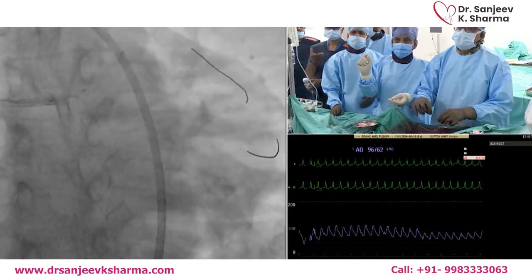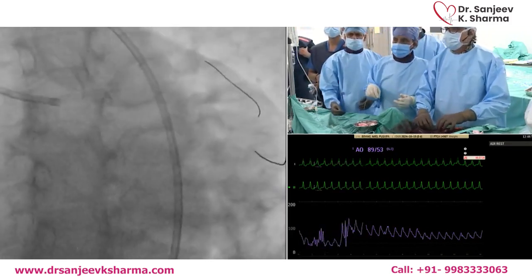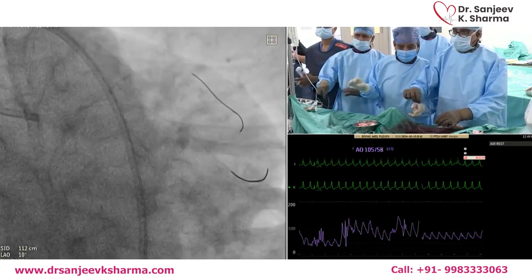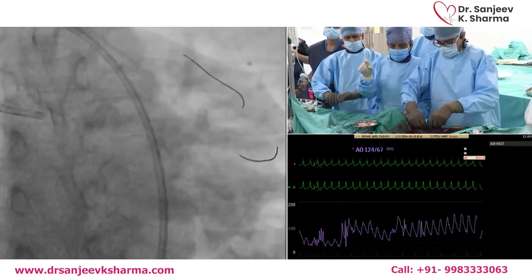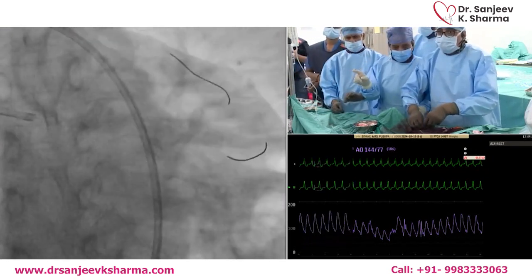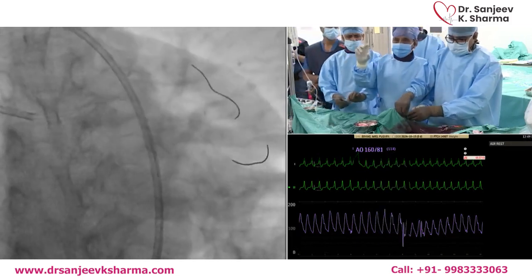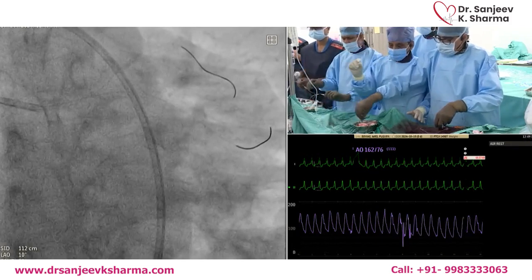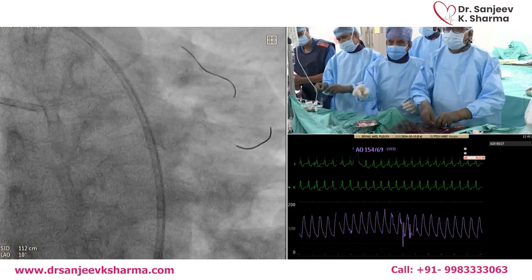So if you take this particular case, we take our imaging score. The score will be, because there is a 360-degree calcium, it is less than 5 millimeter, and less than 0.5 millimeter in thickness. Remember we say the rule of 5. 5 means 50% arc, 0.5 millimeter thickness, and 5 millimeter in length. So this one, there's one circular calcium, one that was barely 2 millimeter in length.